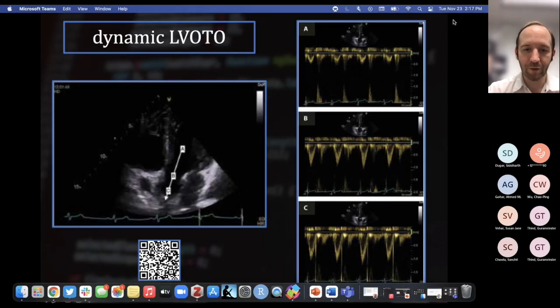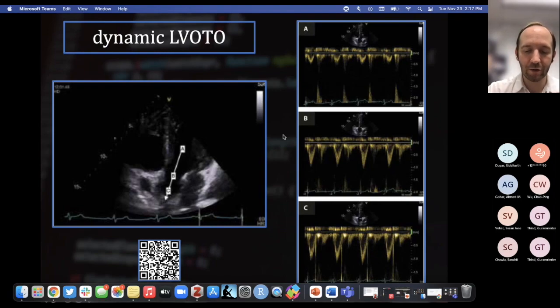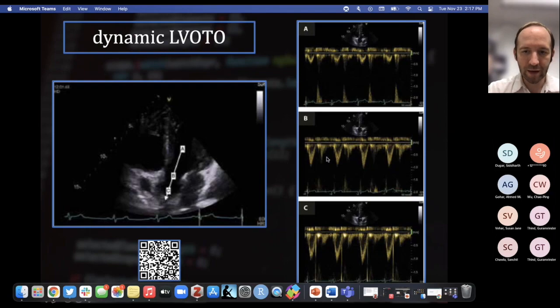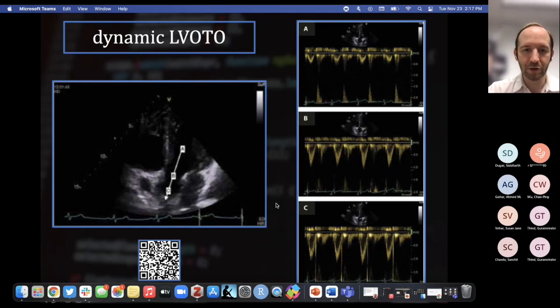This diagram suggests that if you have an elevated gradient across the aortic valve, you should do a survey for dynamic LVOT obstruction across various points. At point A, mid-cavity, the pulse wave jet looks like forward flow away from the probe — flatter and softer than a normal LVOT jet. At point B, the LVOT, you see a typical LVOT jet. In the ascending aorta, the pulse wave jet would look different again. If there was obstruction, you would see peaking at whichever point it was occurring — that's the benefit of pulse wave Doppler.